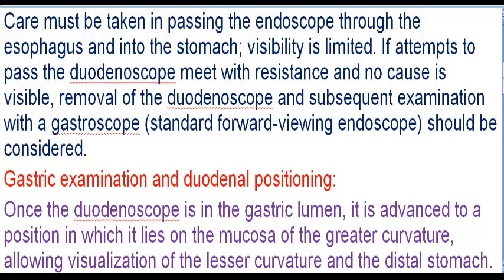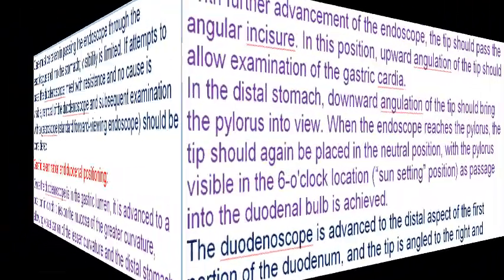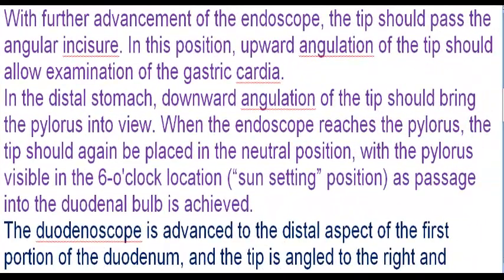Gastric examination and duodenal positioning. Once the duodenoscope is in the gastric lumen, it is advanced to a position in which it lies on the mucosa of the greater curvature, allowing visualization of the lesser curvature and the distal stomach. With further advancement of the endoscope, the tip should pass the angular incisure. In this position, upward angulation of the tip should allow examination of the gastric cardia. In the distal stomach, downward angulation of the tip should bring the pylorus into view.